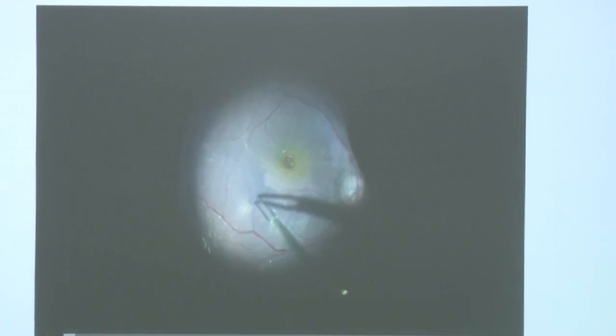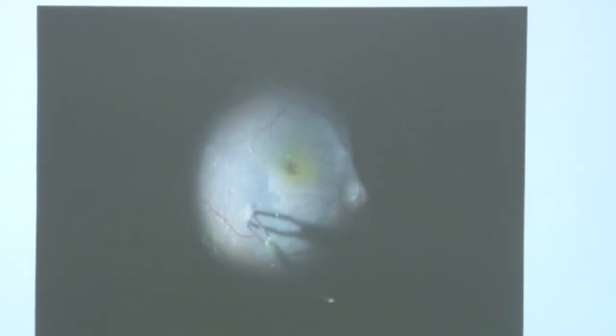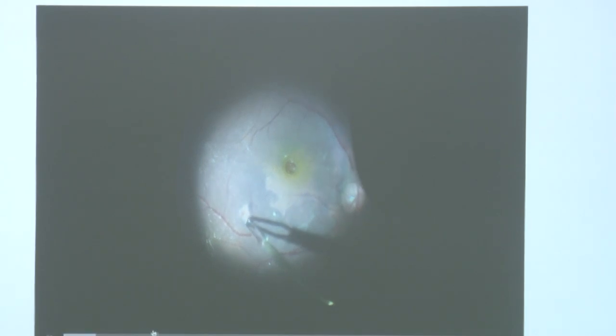This is a case of a large macular hole, so we decided to do the inverted ILM flap technique. There are many techniques available — some surgeons do the cabbage technique, peeling all around and leaving small patches of ILM and then tucking them inside the hole.